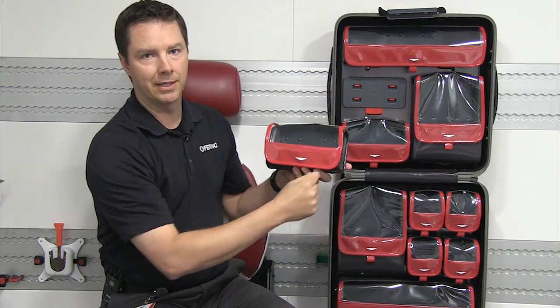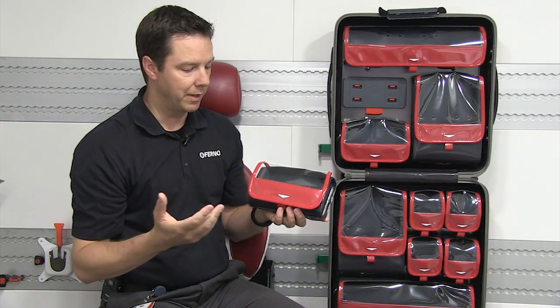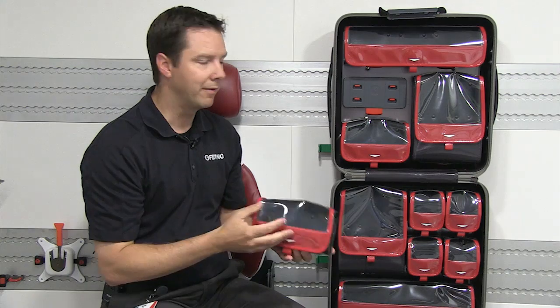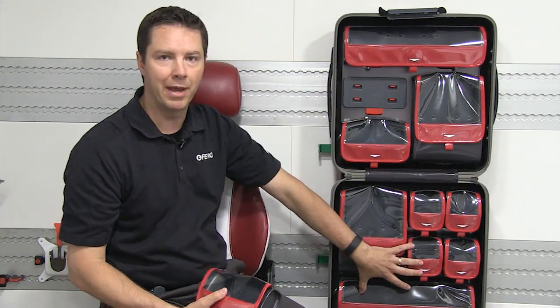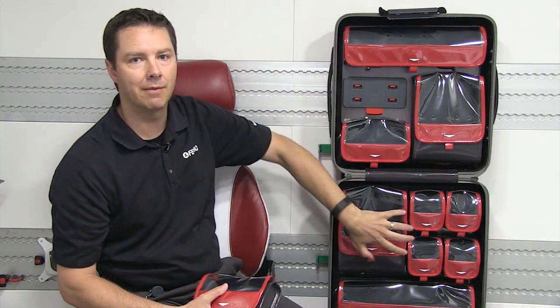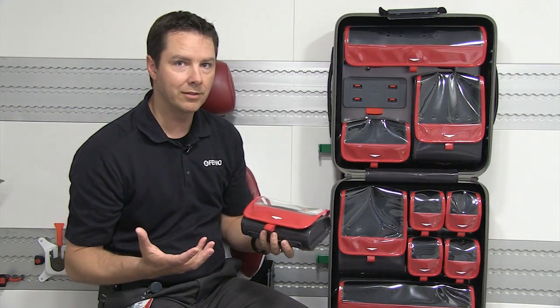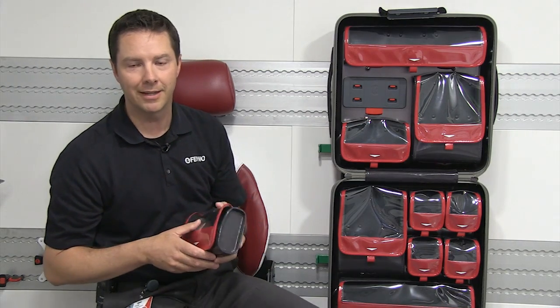So this whole band would be yellow or red or green or blue, similar to maybe the colors used for oxygen and trauma and maybe pediatrics and so forth. You could set it up like a Broselow tape. The field trial that we're doing in Missouri currently has a pediatric dedicated bag that uses a bunch of these size pouches, and they're set up like a Broselow tape down through them for different sizes of kids that they would see during routine calls. So hopefully that answers that question. Absolutely, it's capable of being color coded, and that's the design intent.